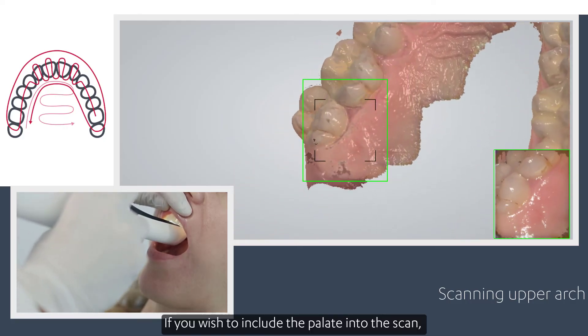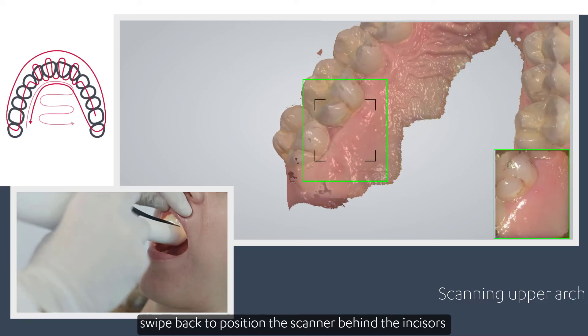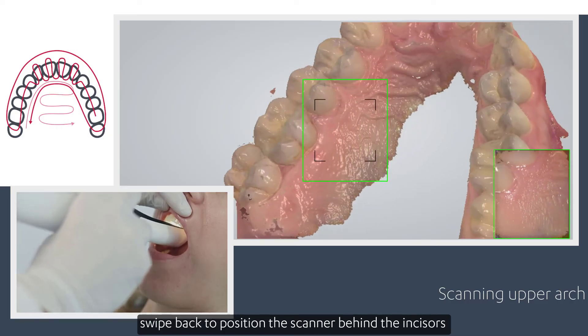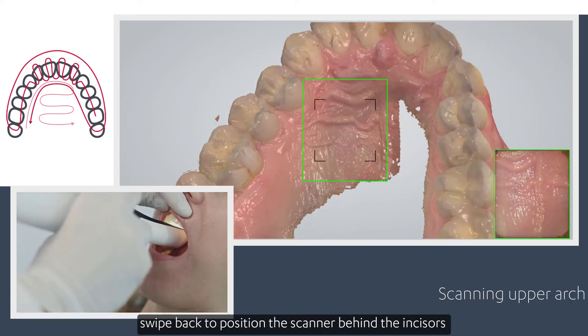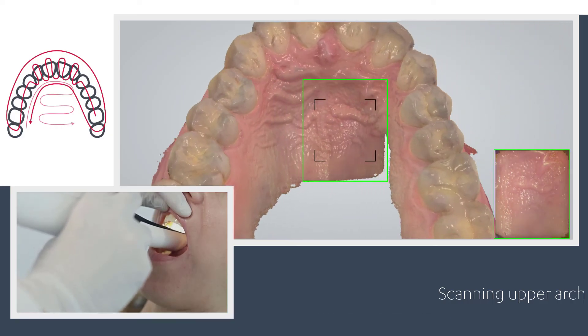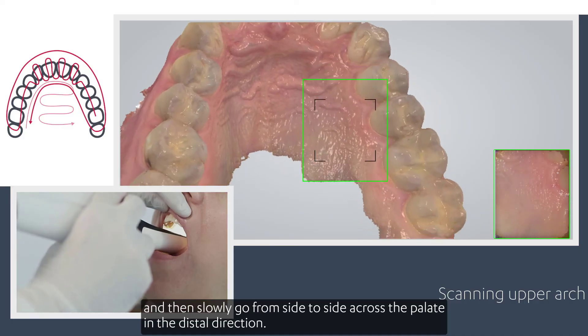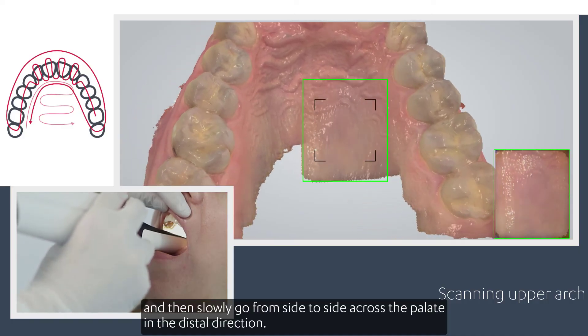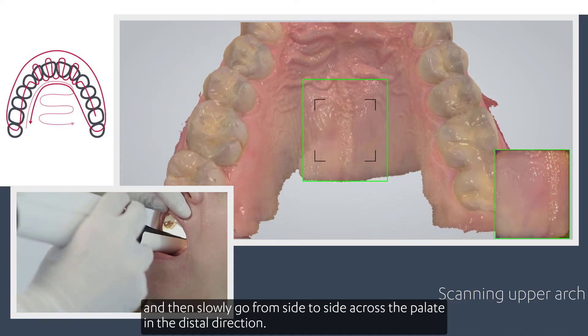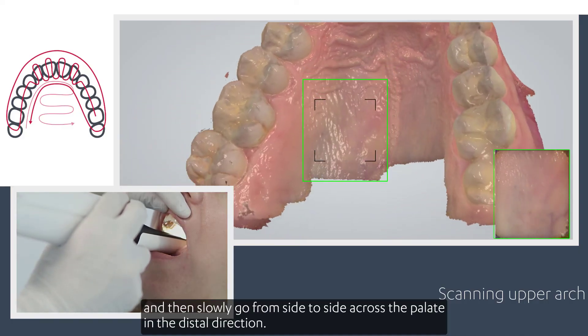If you wish to include the palate into the scan, swipe back to position the scanner behind the incisors and then slowly go from side to side across the palate in the distal direction.